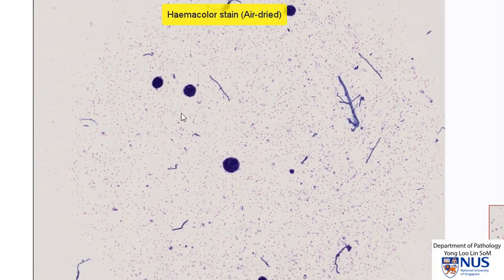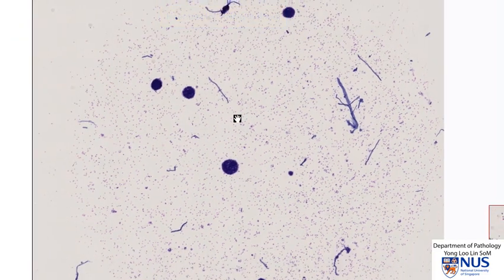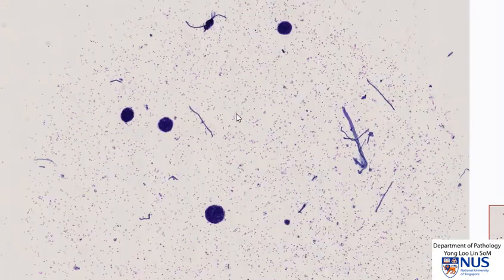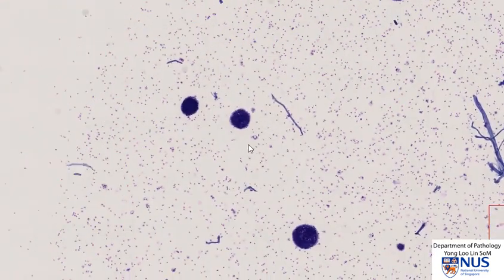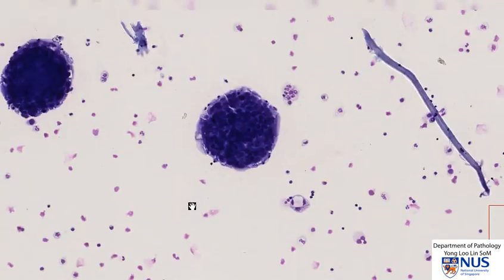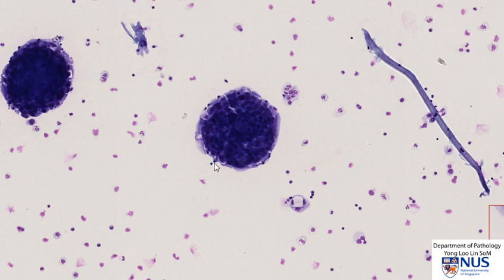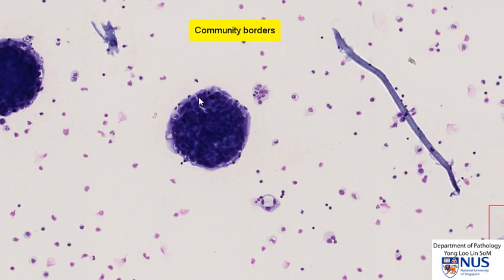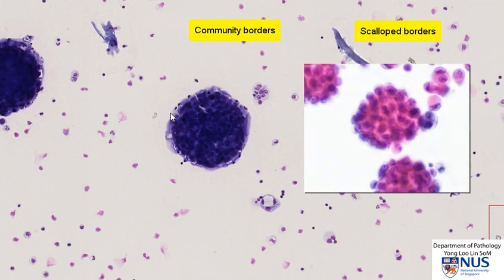At low power, we can pick up these very round cell balls or cell clusters. As we move on to higher power, we can note that the borders of these cell clusters are very, very smooth. This is known as community borders, and this is opposed to scalloped borders, where you can see individual cells poking out in a scalloped kind of outline.